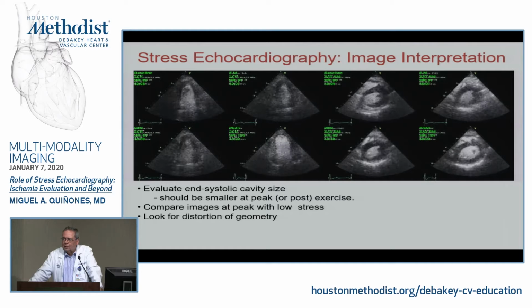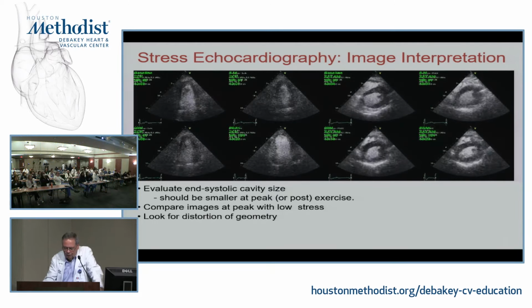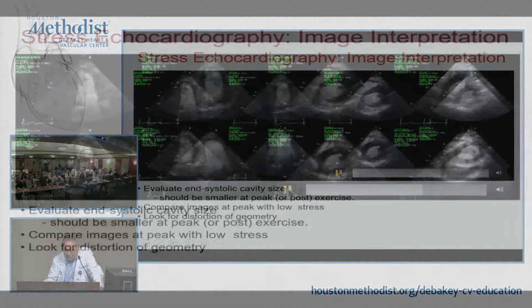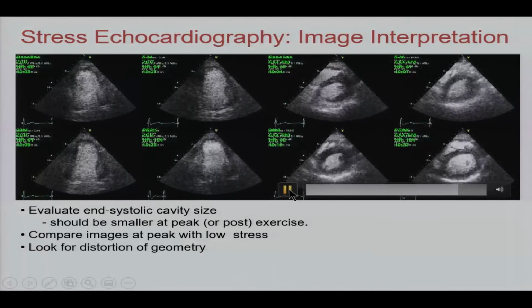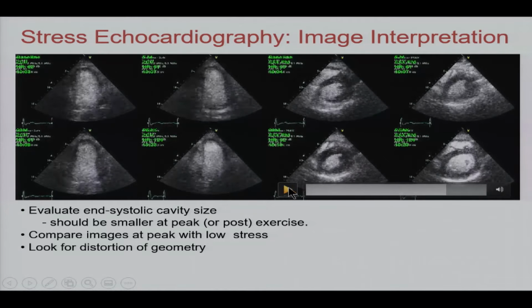Is this a normal stress echo? Peter? No. Yeah. And we can nicely see, I'll eventually get it. There we go. End systolic cavity here.